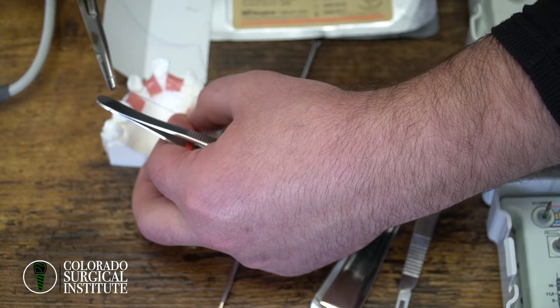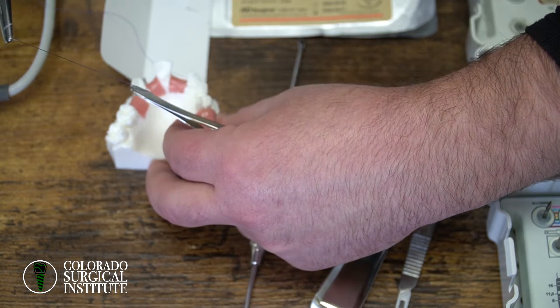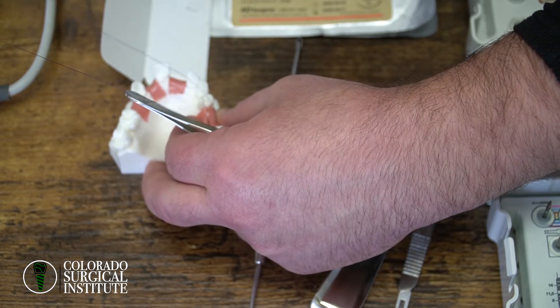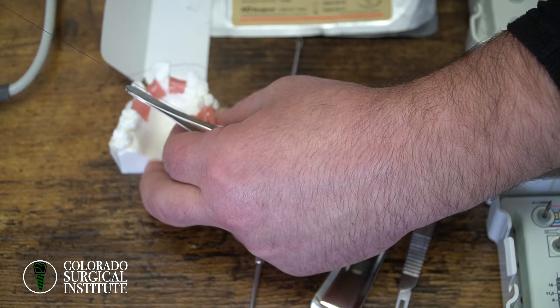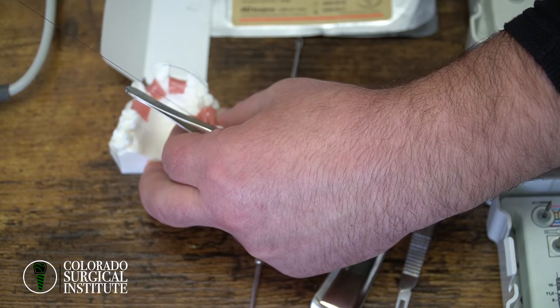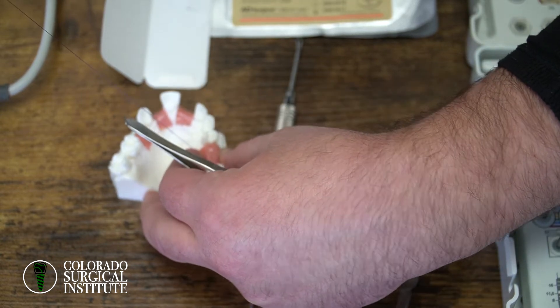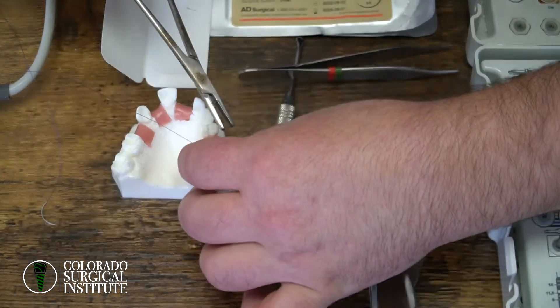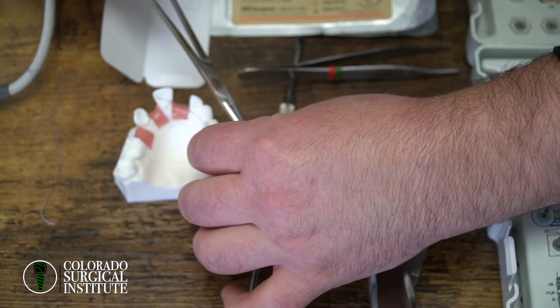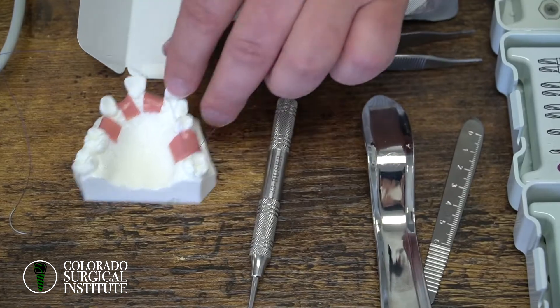This model is very hard to get the suture through. There are definitely other models out there that are way easier. So if you're trying to practice your suturing, ask us and we'll get you some recommendations on models that are way easier to work with.